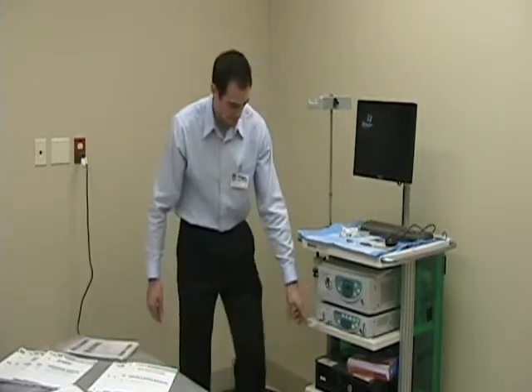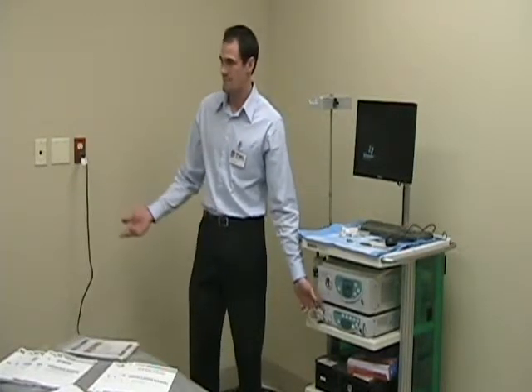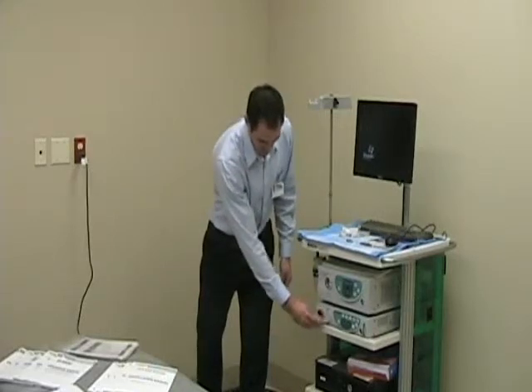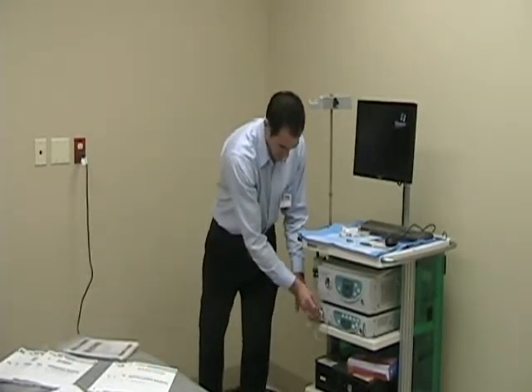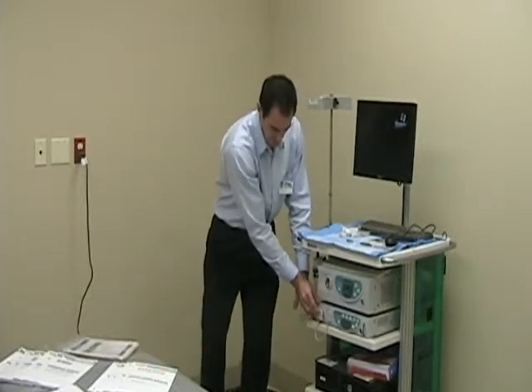There's 2 ports on here because Fujinon has a forwards and backwards technology. You can put like their 400 series scopes, scopes from 10, 12 years ago. You can plug those into here. You can also plug their brand new scopes. They came out with the 530 and 590 series scopes. New port, it's a little luer locking port, but yeah, they can pretty much use the same processor.